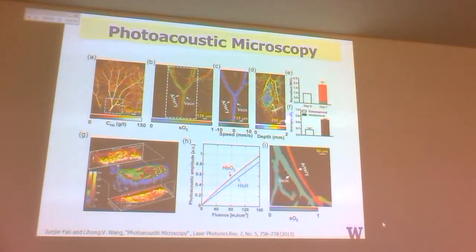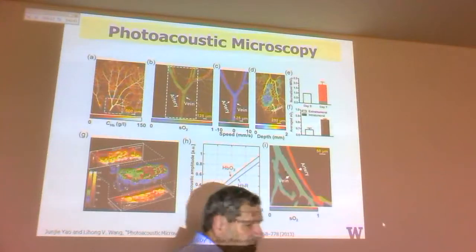So this is a realm, and I would say from the pure research side of photoacoustics, this is the direction where people are going, looking at how far you can take this. So there's basic studies where clinically it could come in, like I said, there's areas like flow cytometry, where you're trying to do cell identification, cell sorting, based on some signatures and using photoacoustic signatures instead of optical signatures, especially if you can do it label-free.